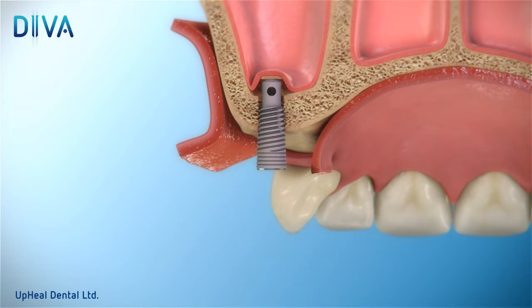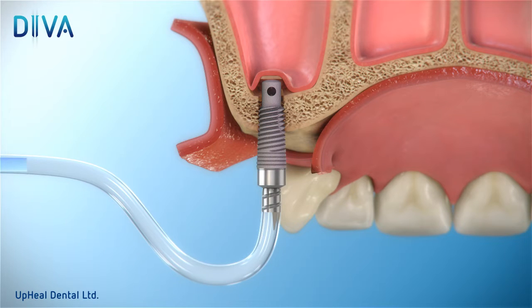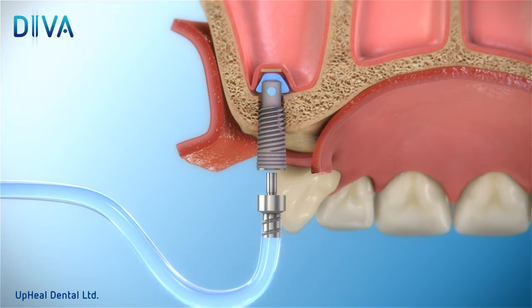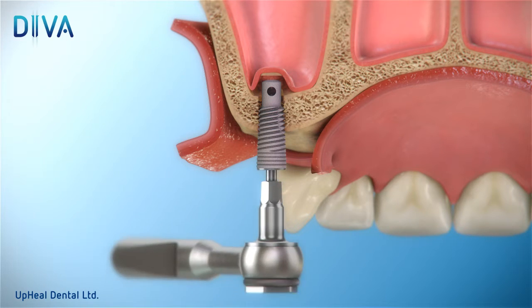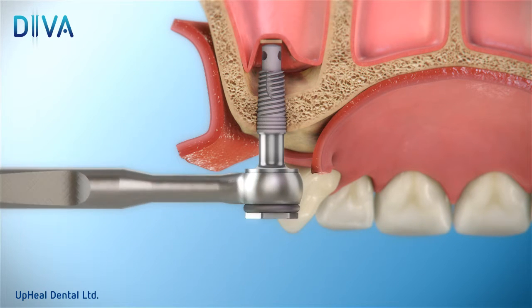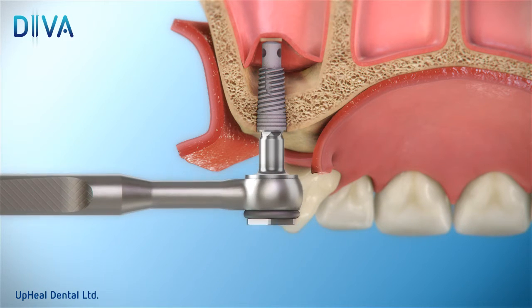Continue to perform one cc saline rinse followed by one millimeter ratchet rotation several times until a countersink for the device is formed. This gentle procedure elevates the membrane intact without perforation.